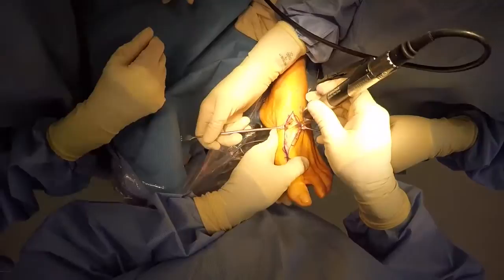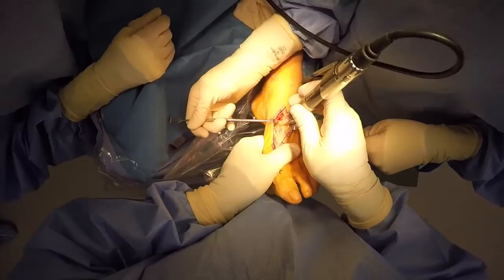So I can come from this angle. This way I can look down, I can look at the shaft of the metatarsal also.